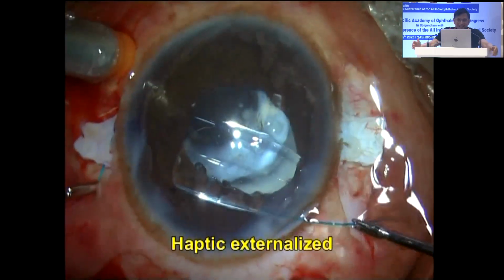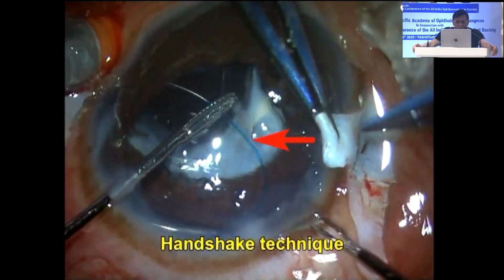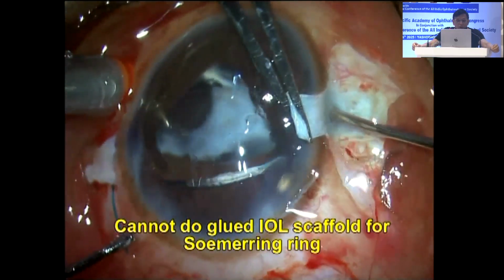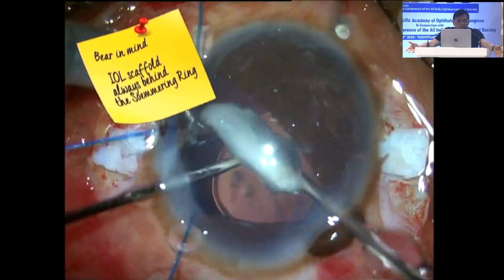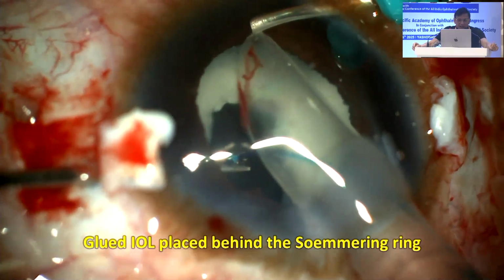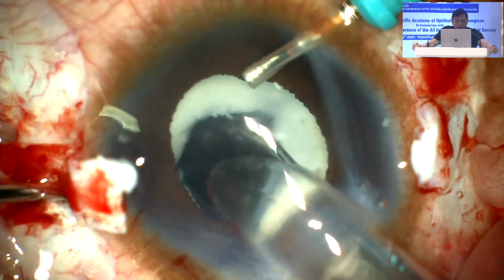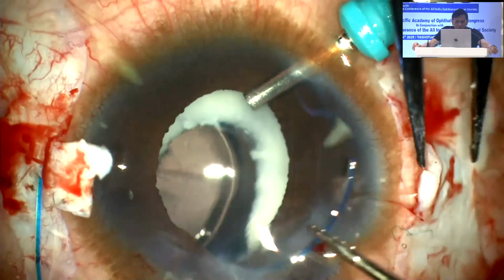Look at this case, another case, but here I'm showing you a mistake. I'm doing the scaffold, trying to create it, but look at the mistake. I'm doing it above the Soemmering ring. How can I ever remove the Soemmering ring if my IOL scaffold is above it? So I have to go behind the Soemmering ring. So now you see, I'm catching the haptic, going behind the Soemmering ring. Now one haptic is out. Now I'll do the handshake technique.